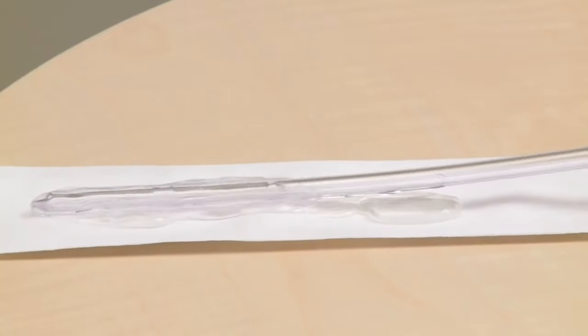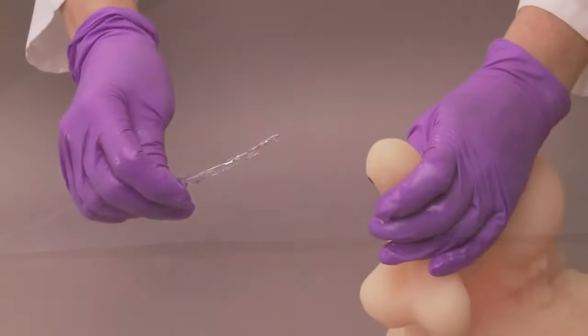or whatever you have been taught to use for cleaning your genital area. Then, with your other hand, pick up the Apogee Intermittent Catheter.